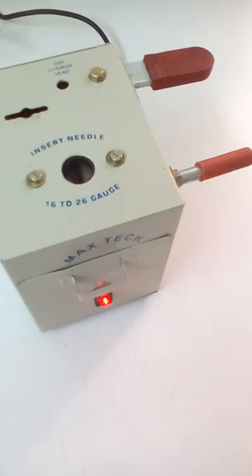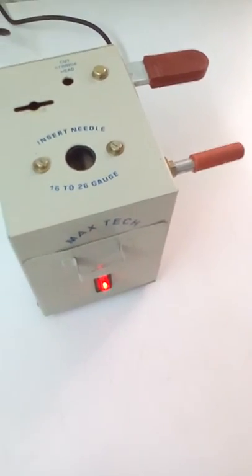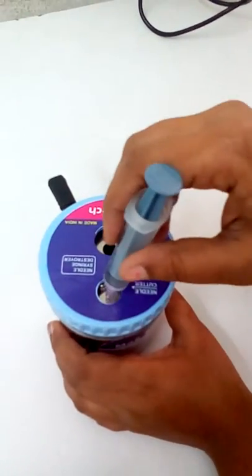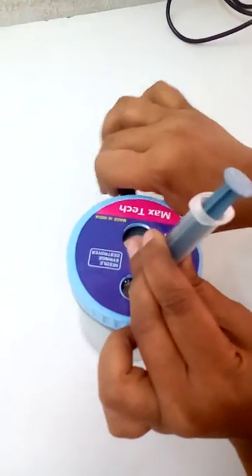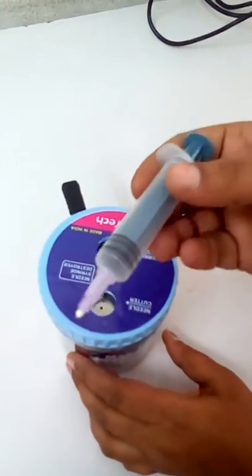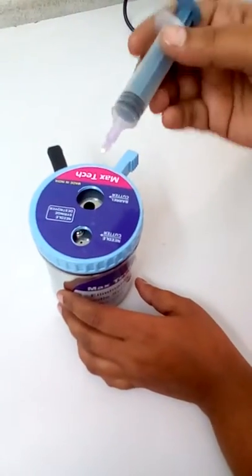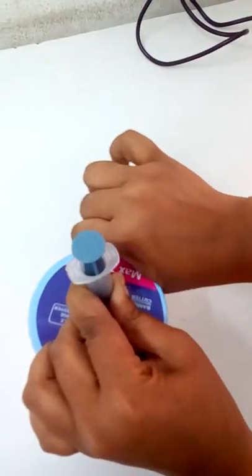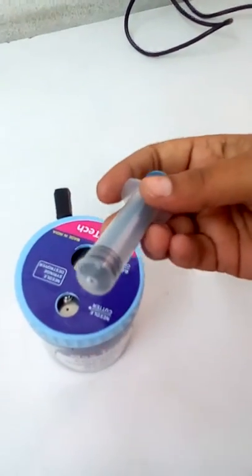We also have a manual needle destroyer, Max Tech M. The needle is inserted into the needle hole, the blades with a snap action finish the needle, and in the second hole the nozzle gets cut.